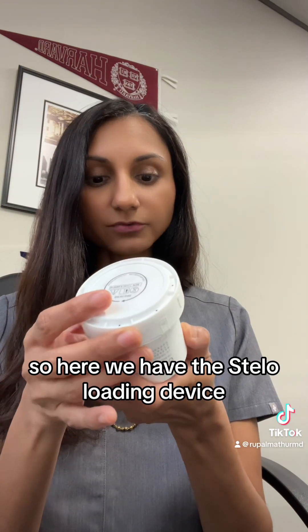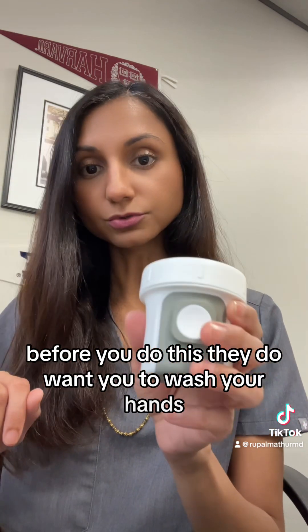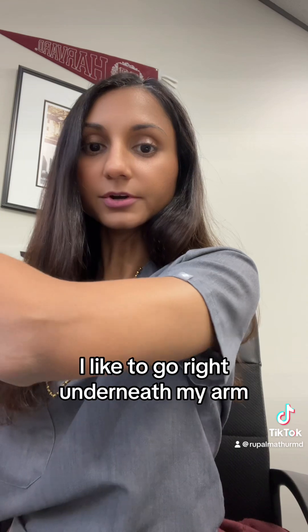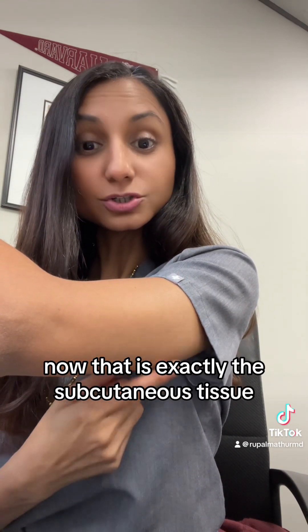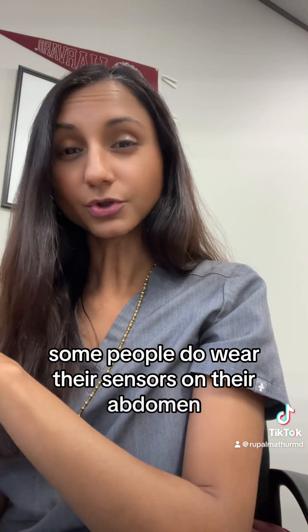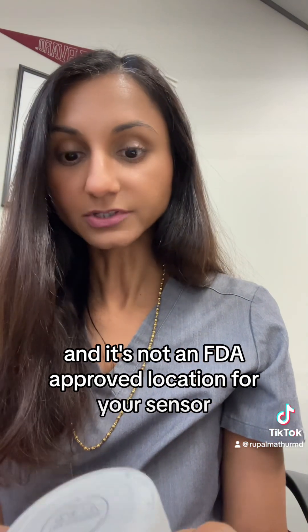Here we have the Stelo loading device. Before you do this, they want you to wash your hands — I'm going to use some hand sanitizer. The place to install the sensor is going to be the back of the arm; I like to go right underneath my arm. You can see some of the subcutaneous tissue there, and that is exactly where you want the sensor for the best accuracy — that's what's been studied. Some people do wear their sensors on their abdomen, but that has not been studied and it's not an FDA-approved location for your sensor.